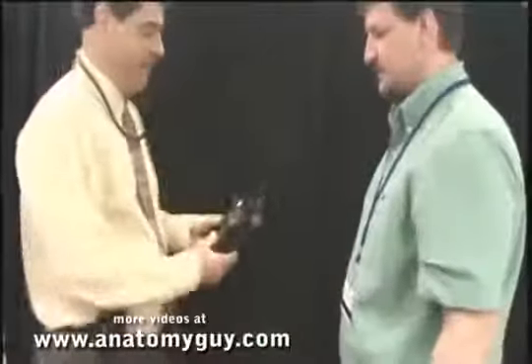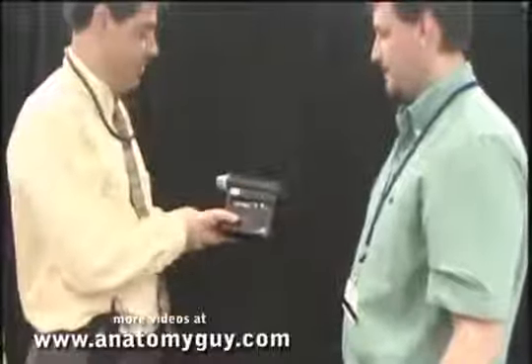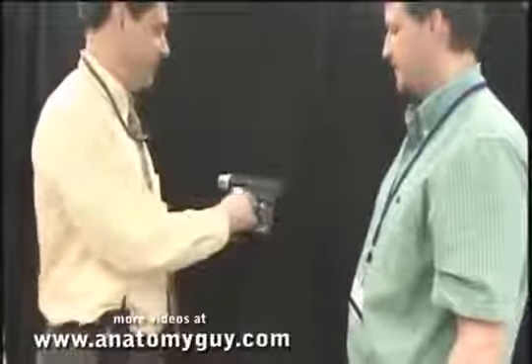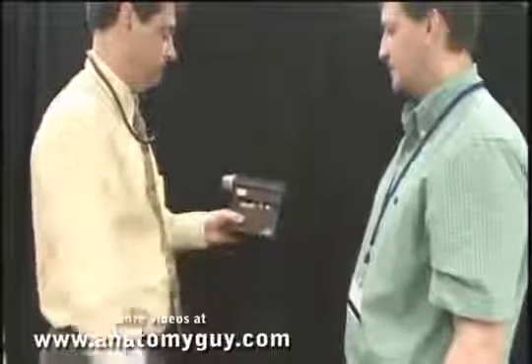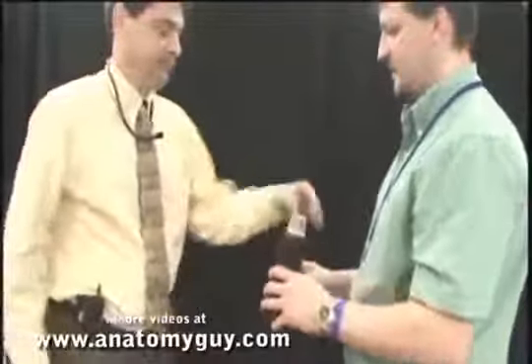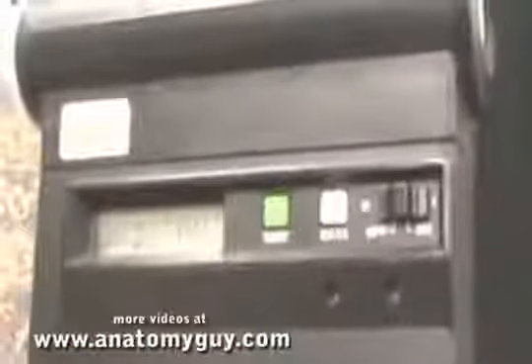Things that can mess up the test is breathing in before, coughing during the middle of the test, pausing. This machine will pick those up. I'm going to ask you to do a bad one, because that was a good one. So this one I want you to do a cough in the middle of it. The machine won't beep until there's no air flowing through the system. Let's hope it does. Bad start. Good enough. So now we'll do some data collection.